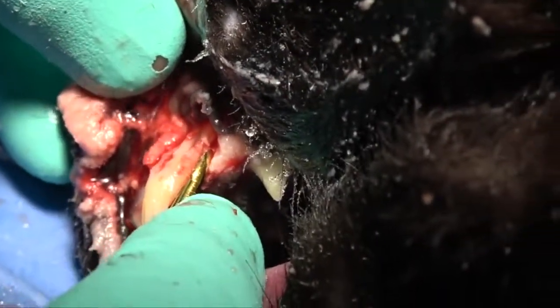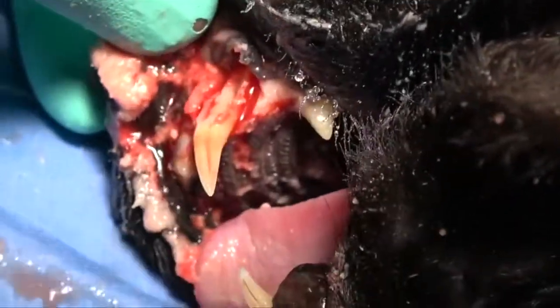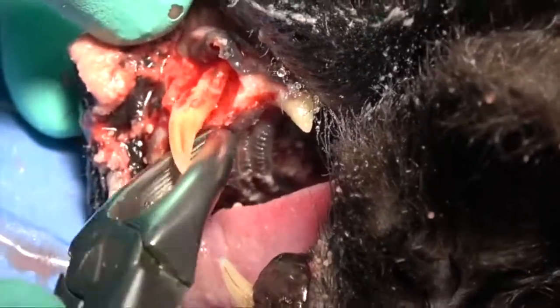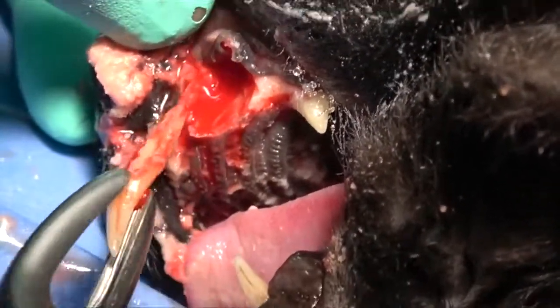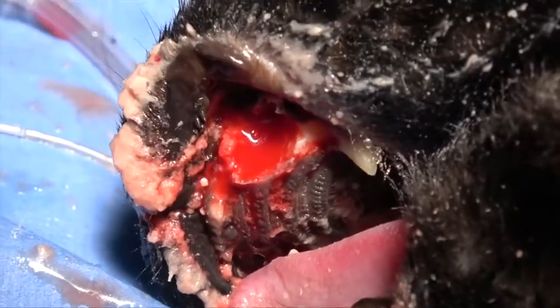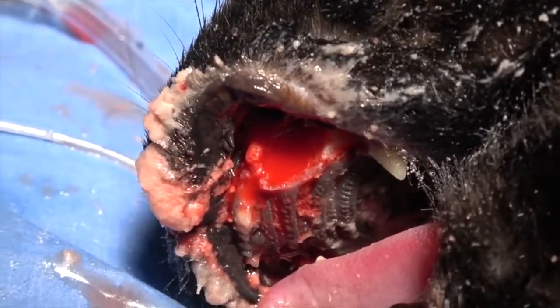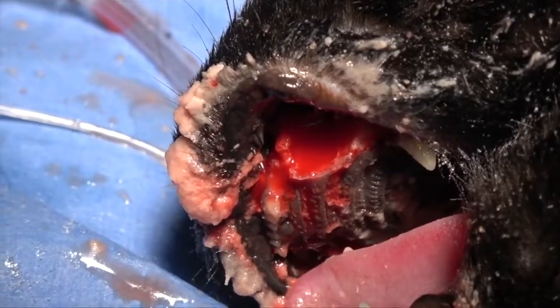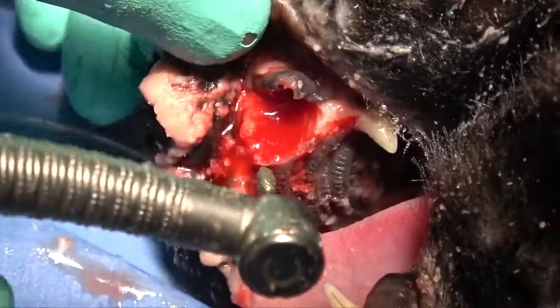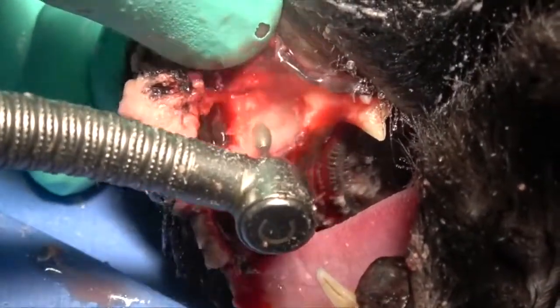We'll start with the distal aspect. We've already got really good mobility — just come right in there and extract that whole tooth root very quickly and easily. Now we're going to take this through to completion of this entire procedure, and consequently we'll show you how we suture.